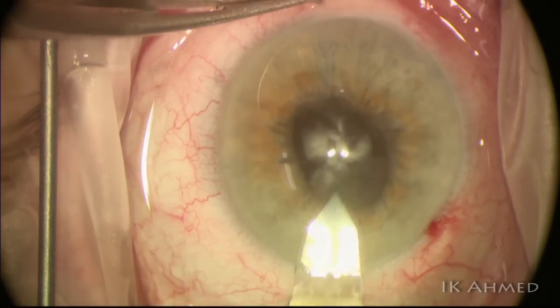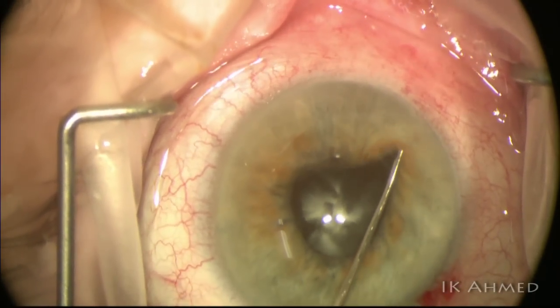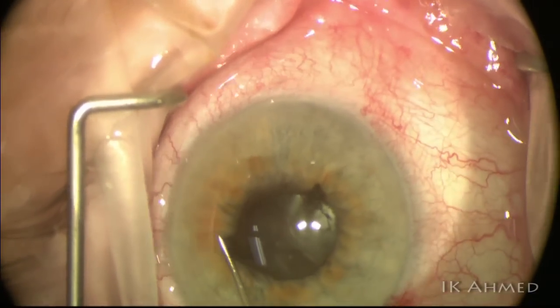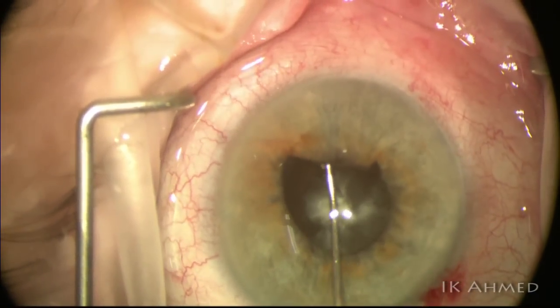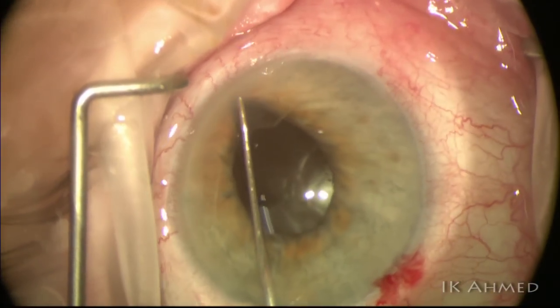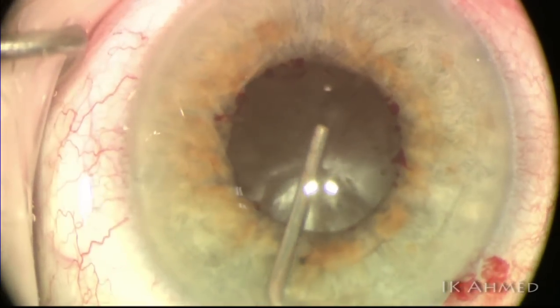Clear corneal staining is present here. We release the posterior synechia from the anterior capsule gently with a Kuglin hook. The first priority here is to ensure we have an adequately sized pupil to work with. It will be important to get a continuous curvilinear capsulorrhexis of reasonable size to safely remove the cataract.